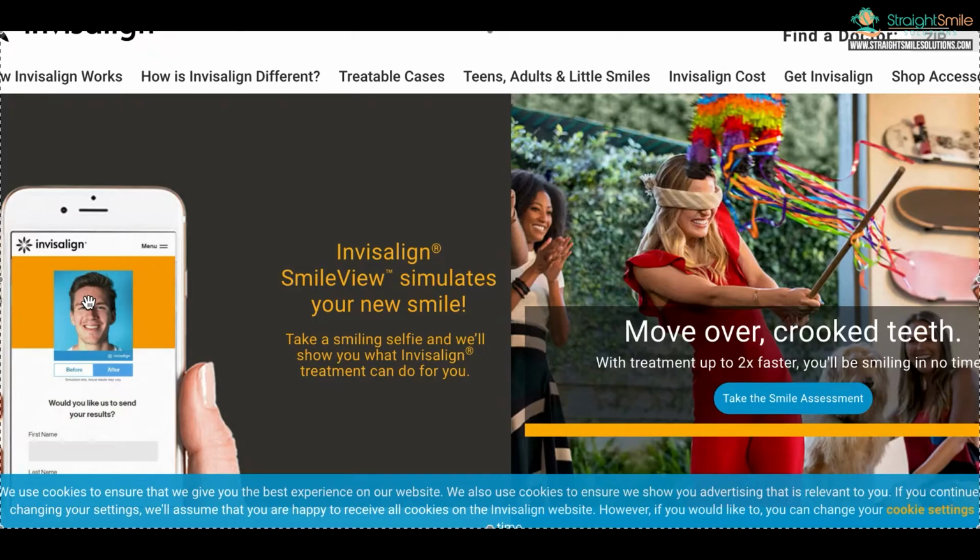It's free at the moment. Like I said, you're going to have to opt into it. You're going to have to take the class, which was 27 minutes long. From there, you'll be able to select patients. You can invite all your patients, but you have to select them.